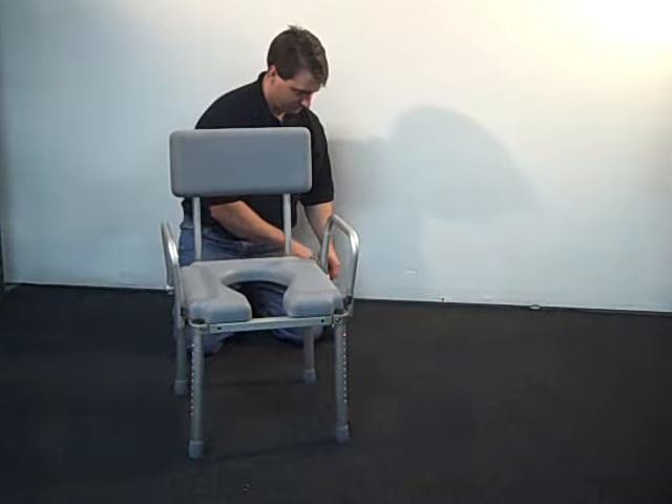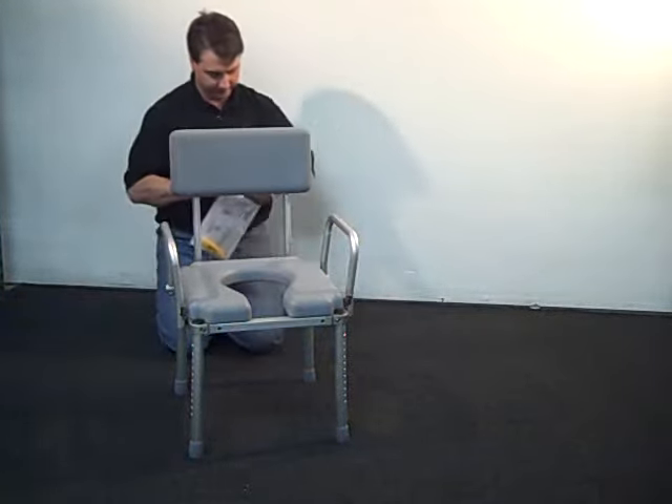Now that the back has been installed, the chair is ready for use.